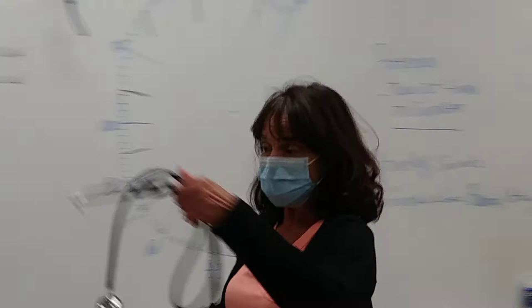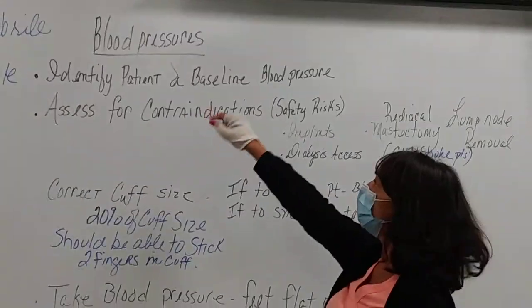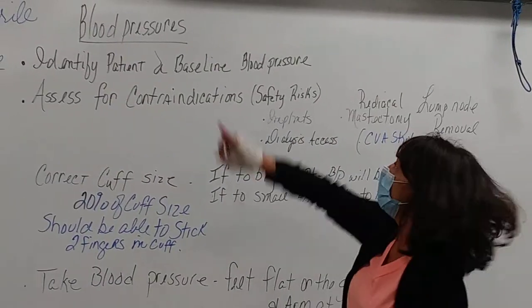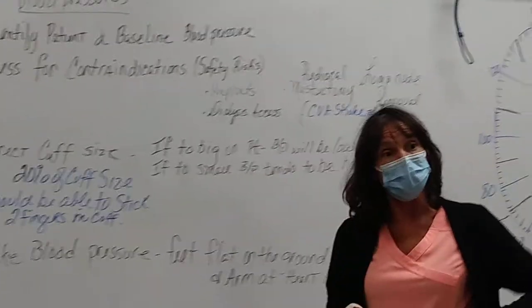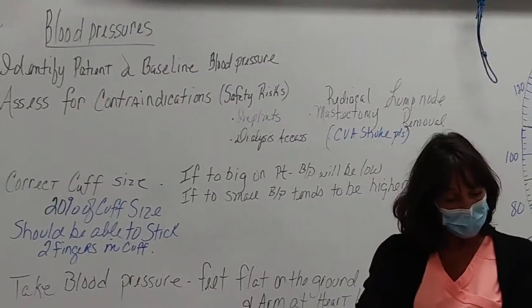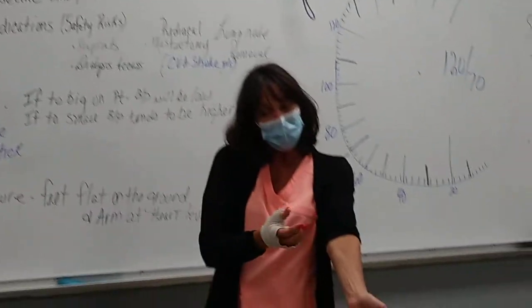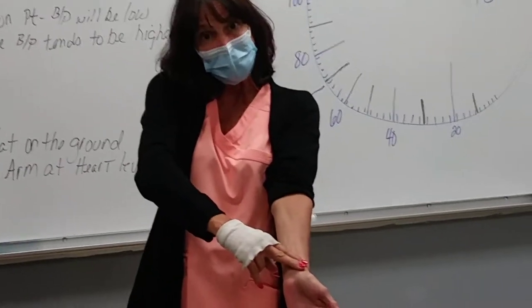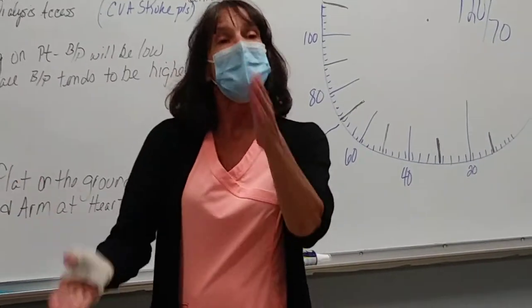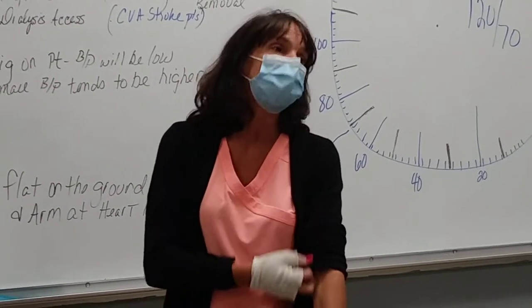And just some notes to take here. Before obtaining a blood pressure, you want to identify your patient, date of birth. You also want to get a baseline blood pressure, a peak. We'll show you how to do that as well. But what you do is feel for the radial pulse. With the cuff on, you're going to pump it up till you cannot feel that radial pulse anymore and add 30 to that number. This gives you a baseline of how high to pump when you're obtaining a blood pressure on a new patient.